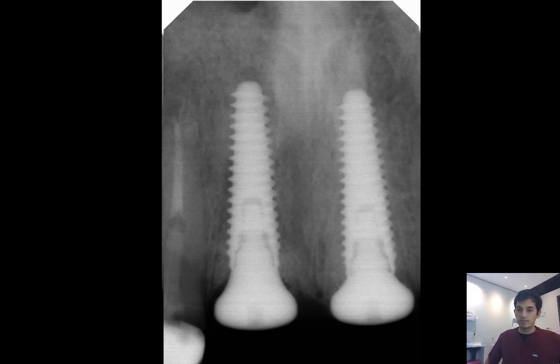When you're working with custom healing abutments or chairside immediate provisionals, it takes a lot of adjustment, measurements, and using a handpiece to trim any excess chairside. And again, we're trying to minimize the use of handpieces to only what's necessary, and putting the titanium healing abutments on just works beautifully for us. It can also be argued that having titanium in contact with your tissues when they're healing is better for the tissues than having acrylic, which is usually there with provisionals.